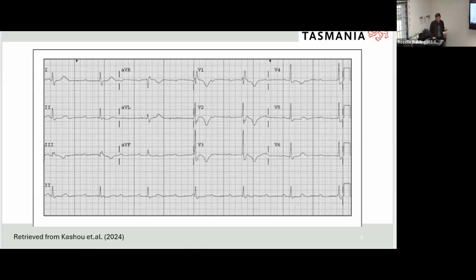All right, so then we need to look at our axis. So from last week, how do we go with our axis and what do we need to look at?